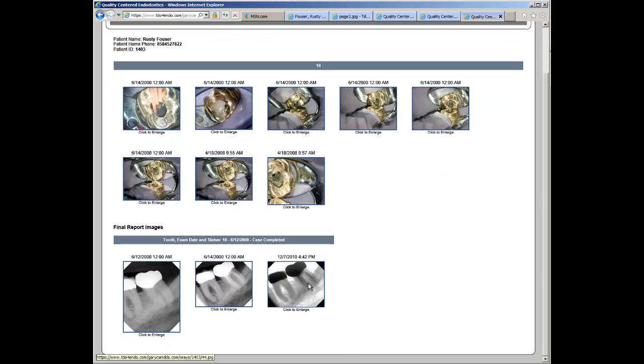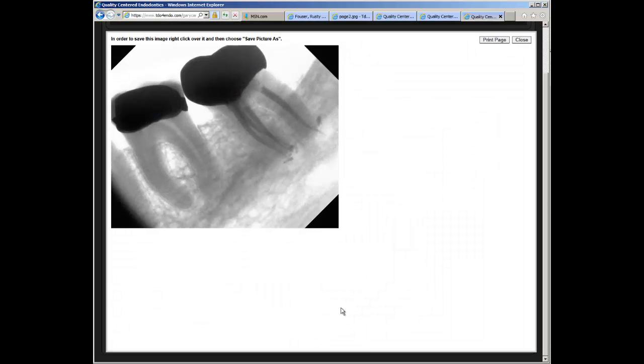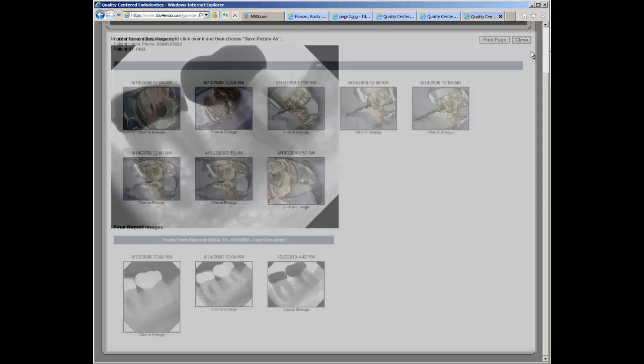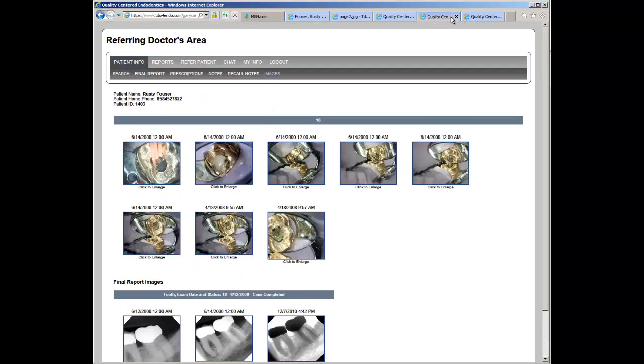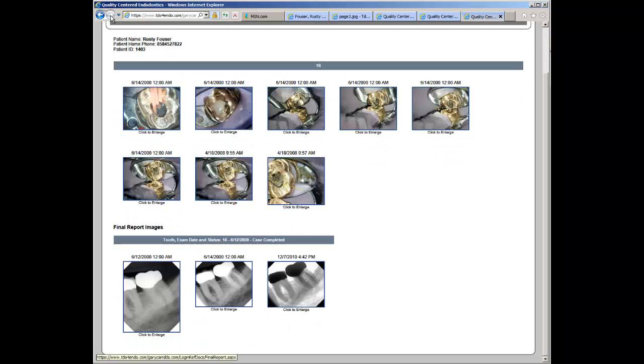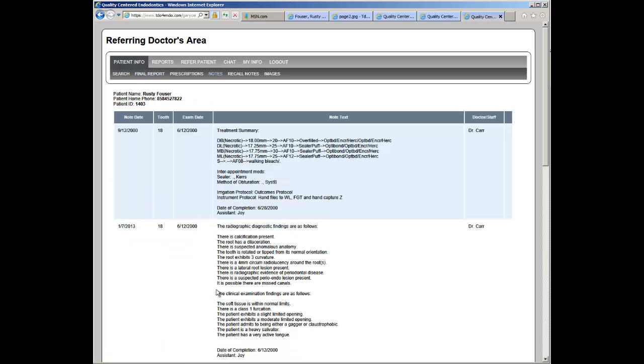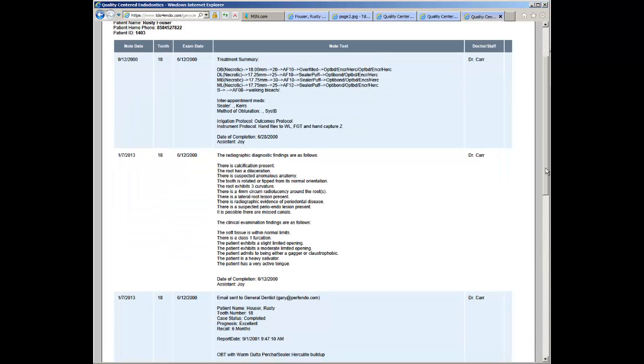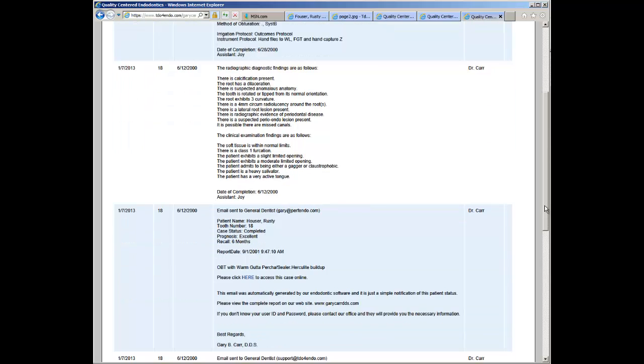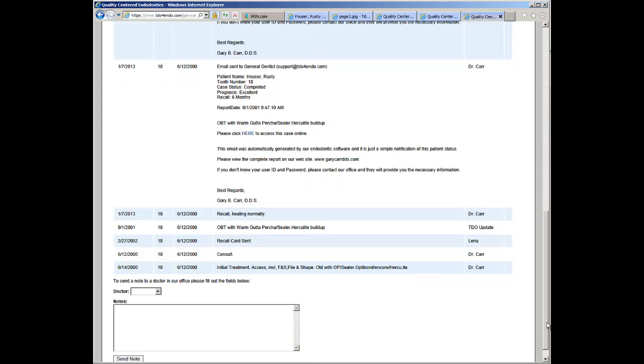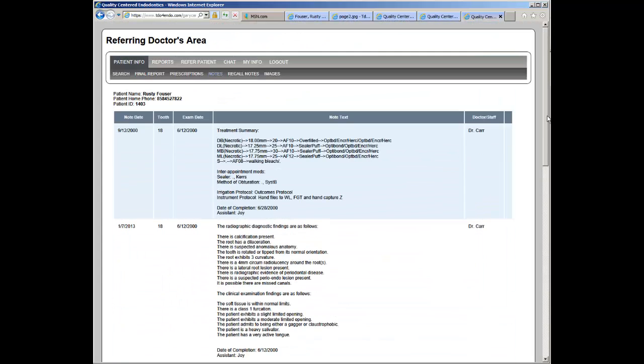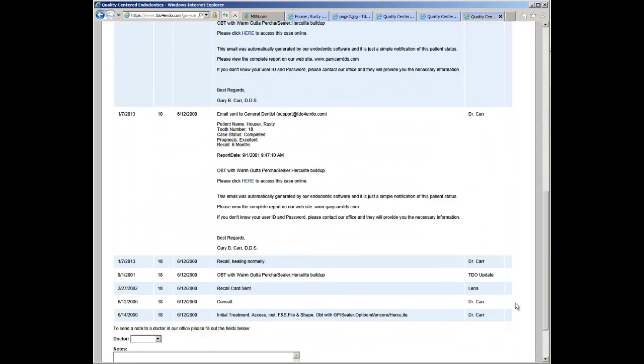Same feature is available with the x-rays. You also have the ability to view notes for the case. All notes entered into the patient's chart that you specify you wish to share with your referral source will come up here available to be viewed by your referring doctor.